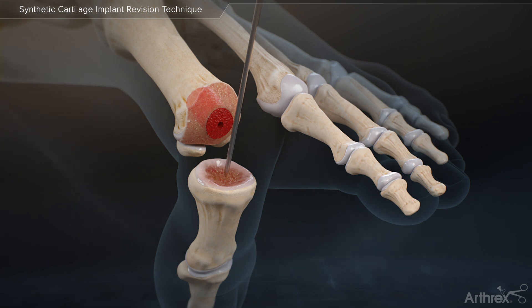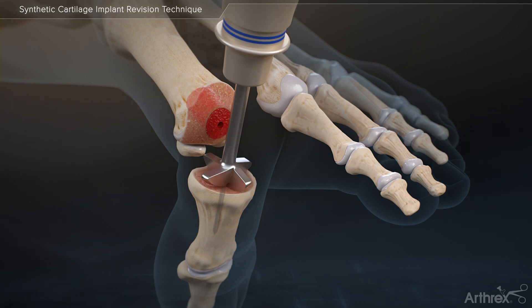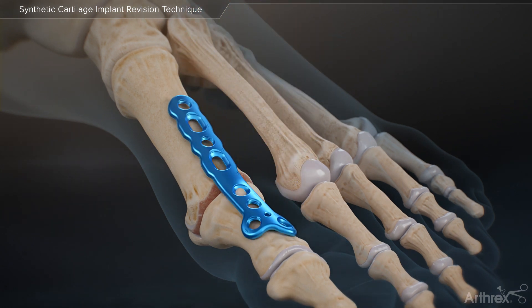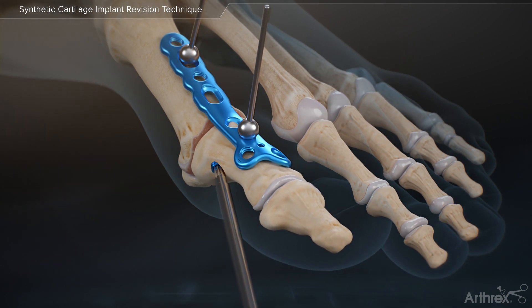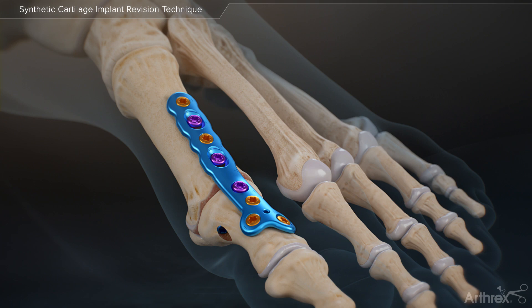Insert a 1.6 mm guide wire into the proximal phalanx and use the phalangeal reamer to prepare the base of the phalanx. Place the joint in the correct position and temporarily fixate the MTP fusion plate with BB-TACs. From this point, continue following standard practices for fixating the MTP plate and completing the fusion.